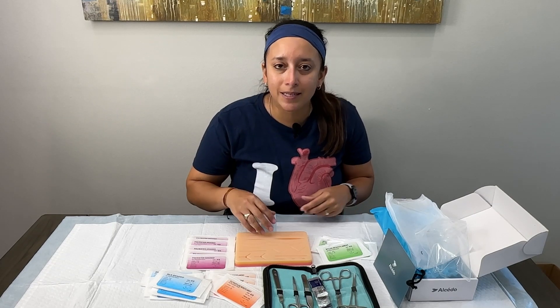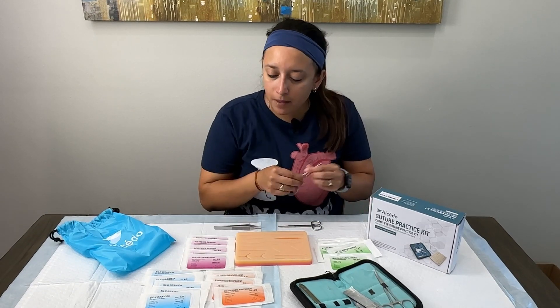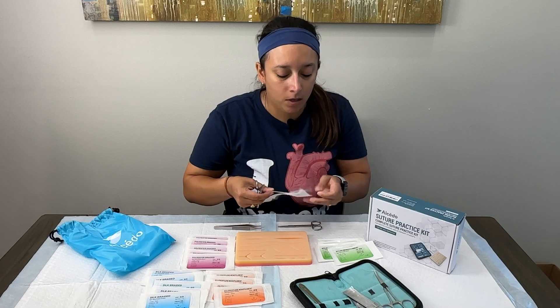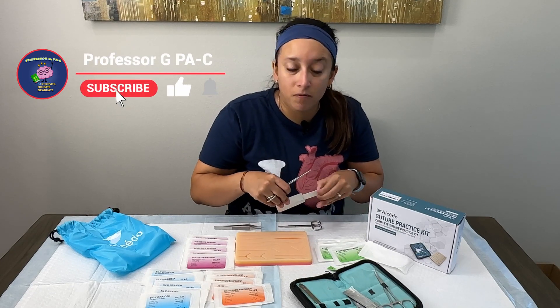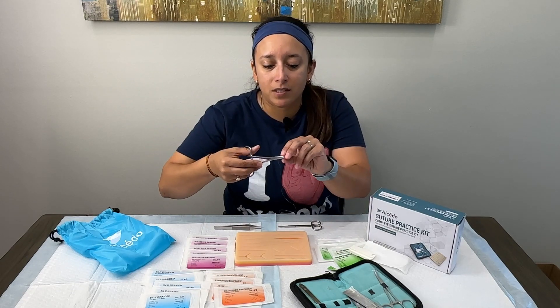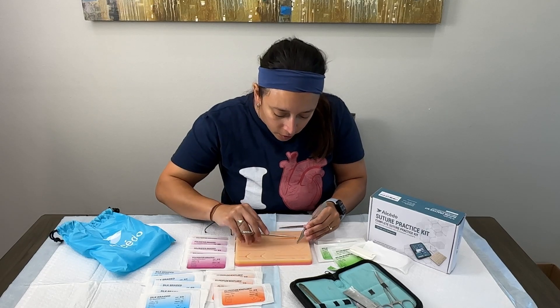In a second we'll take this silicone pad for a test drive and see how it performs. While I'm opening the nylon monofilament 4-0, I want to ask — if you like these videos and want to see more content, put in the comments anything you'd like me to cover. In fact, in a previous video you mentioned the Alcido kit, so that's why I made this video. Now I'm loading up my needle, ready to sew up a laceration — I'll pick this curved one.